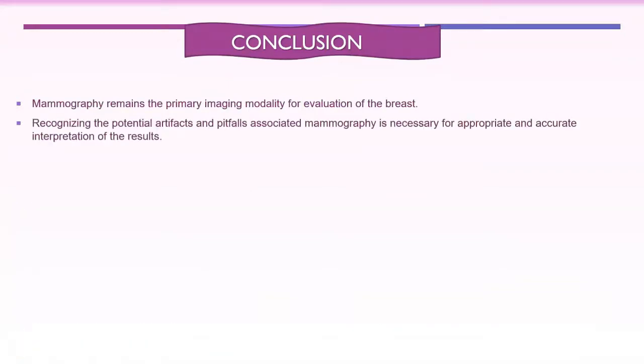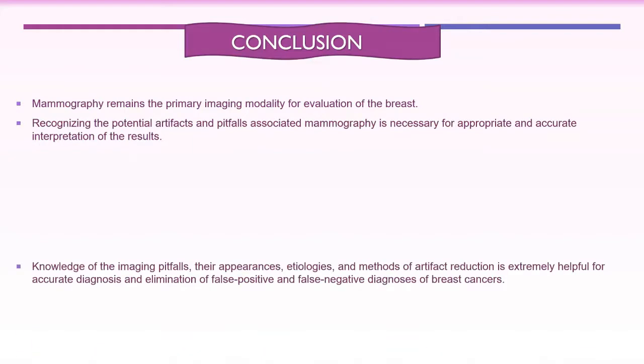So, in conclusion, mammography remains the primary imaging modality for evaluation of the breast. Recognizing the potential artifacts and pitfalls associated with mammography is necessary for appreciating and accurately interpreting the results.